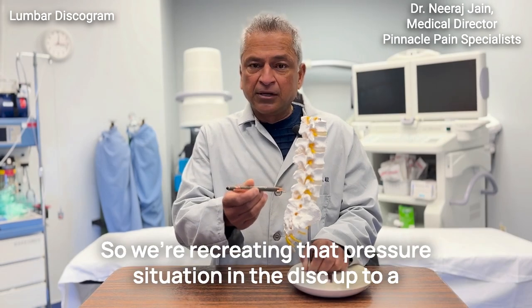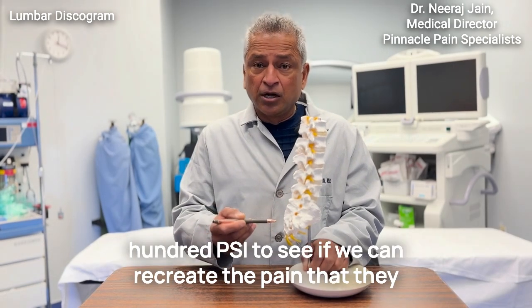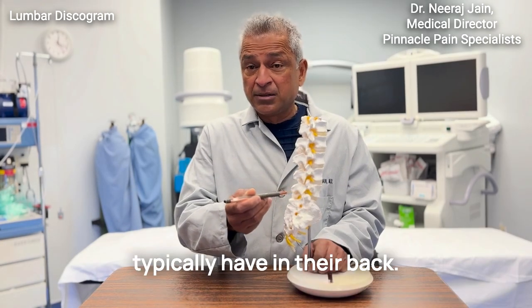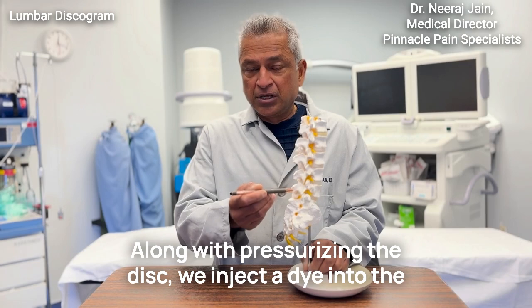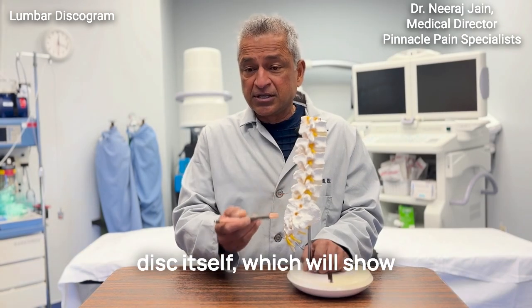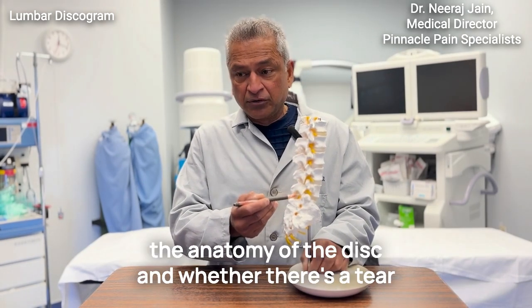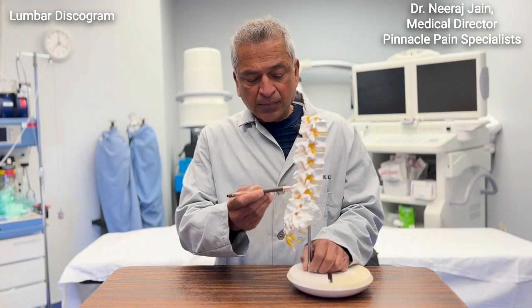So we're recreating that pressure situation in the disc, up to 100 psi, to see if we can recreate the pain that they typically have in their back. Along with pressurizing the disc, we inject a dye into the disc itself, which will show the anatomy of the disc and whether there's a tear in the back of the disc that needs to be repaired.